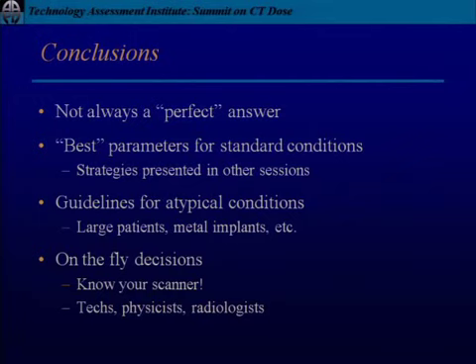Well, it depends. A big part of this is determining what we need, and that's probably the most time-consuming part. I am going to talk a little bit about that tomorrow when I talk about protocols, but getting the right people in the room, getting the right information, getting the consensus of the radiologists, all of that is very time-consuming. Once we know what we need to do, we can get there pretty fast, a few evenings with some phantom images. And then you want to start trialing things on a case-by-case basis, having the radiologist review it in between to make sure you're on the right track at least.